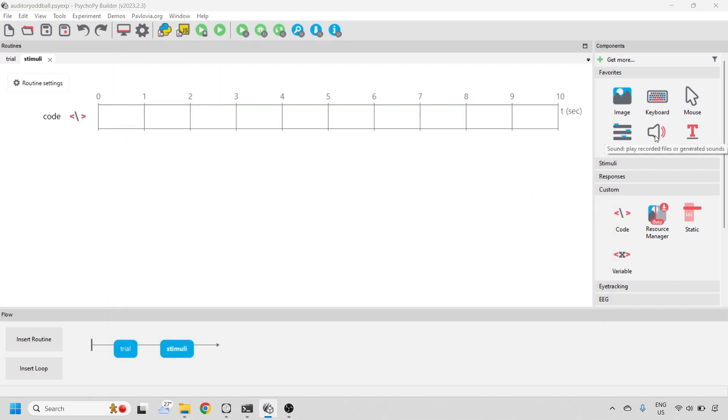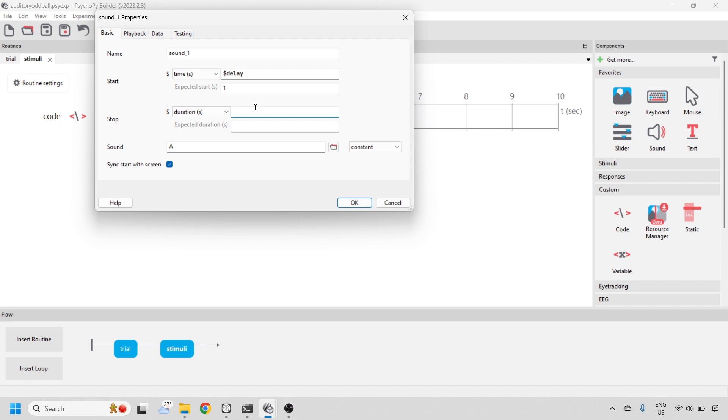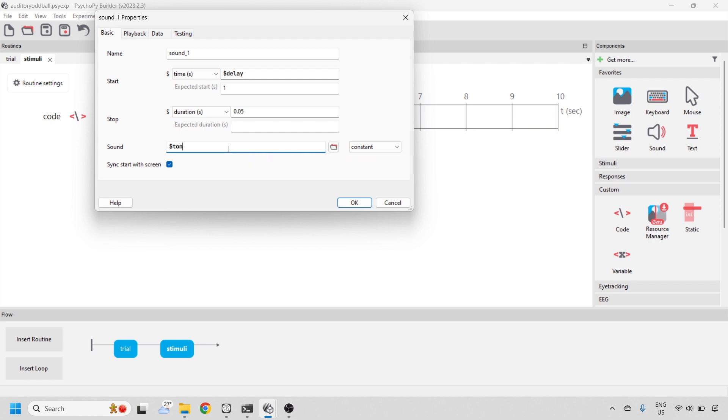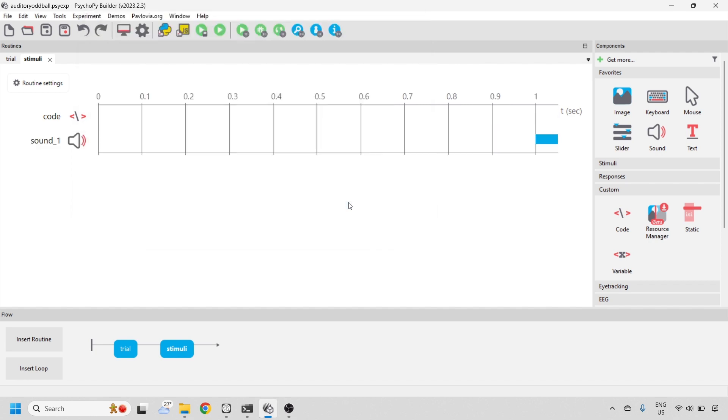Now let's add the sound component. Here we'll add the dollar delay time. My expected start at 1. And we want our tone to be a duration of 50 milliseconds, so change that to 0.05. And the sound that we want to play on every trial is the dollar tone variable defined by the coding component.